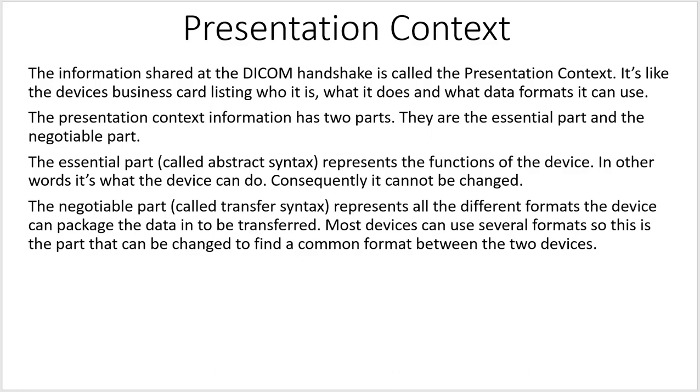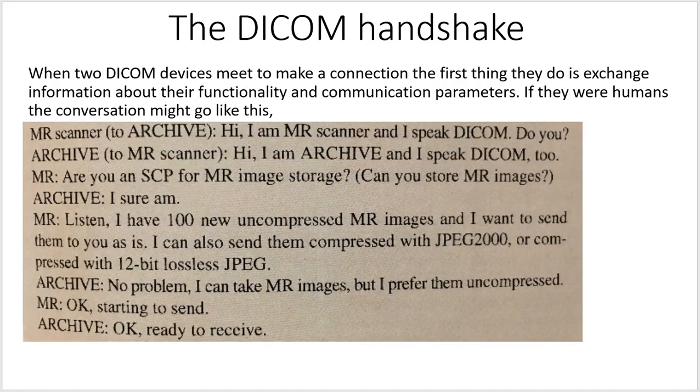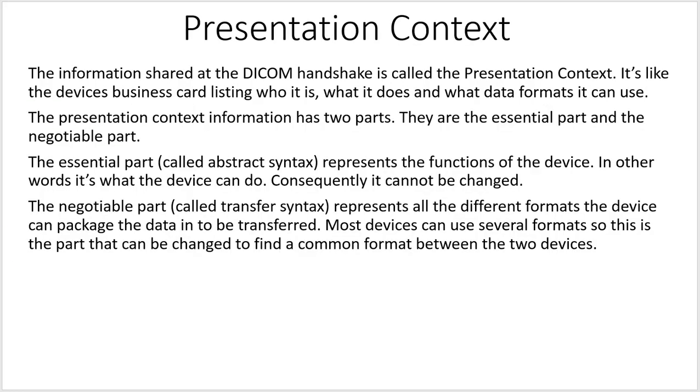The negotiable part, called the transfer syntax, represents all the different formats the device can package the data in to be transferred. Most devices can use several formats, so this part that can be changed to find a common format between the two devices is called the negotiable part, or the transfer syntax. And here you see the transfer syntax, right? I have these images and I can send them with this compression or with this compression, in that format. And then it says, no, I want them uncompressed. That is the transfer syntax.